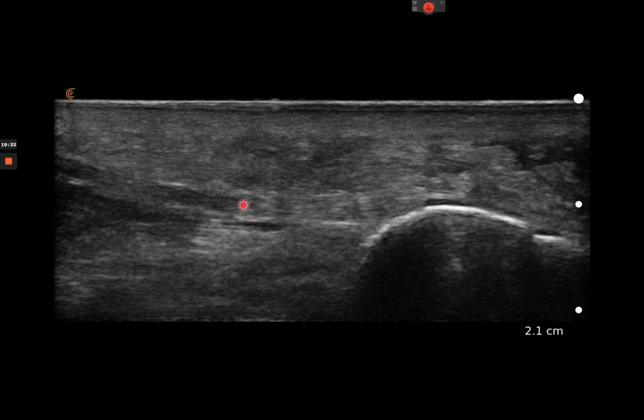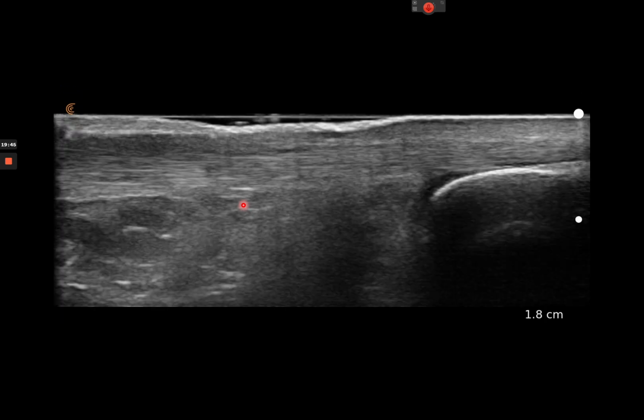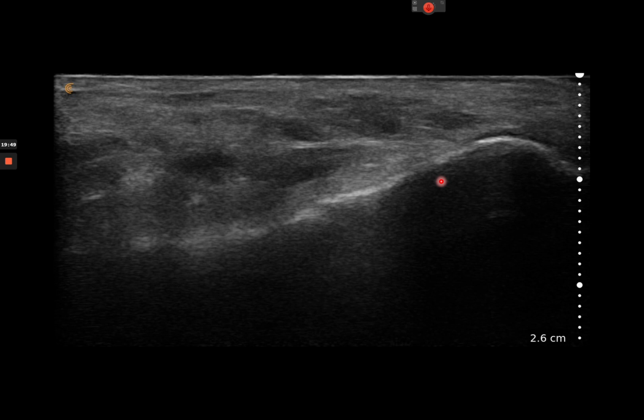Finished. Then we can expand the scan as well. So if it's not plantar fasciitis, what would I expect? We've got someone who's deconditioned, who's had a sudden increase in activity. Her Achilles tendon I check. Again, it looks completely normal. Okay. Then I start having a look on the inside of the heel bone. And this is the medial part of the calcaneus.